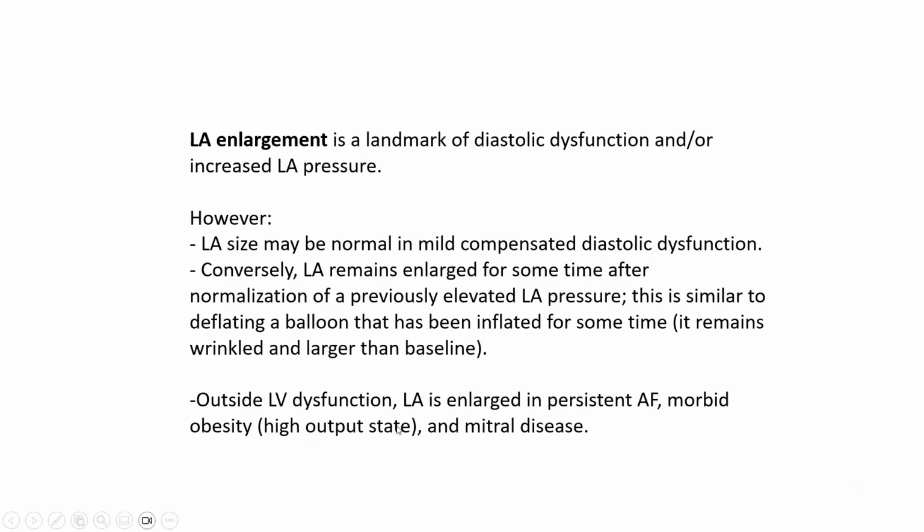Another caveat of LA enlargement is that even outside LV dysfunction, LA may be enlarged in persistent AFib, in morbid obesity with its high output state, and in mitral disease. But keep in mind that persistent AFib and morbid obesity are frequently associated with diastolic heart failure. So LA enlargement in those subsets may very well be increased LA pressure and diastolic heart failure, but it is less specific in those contexts.